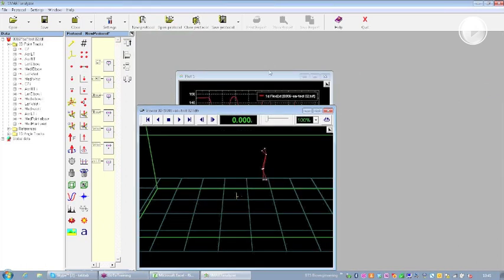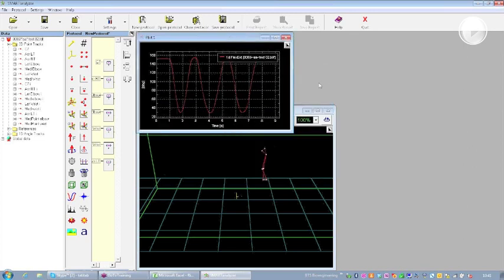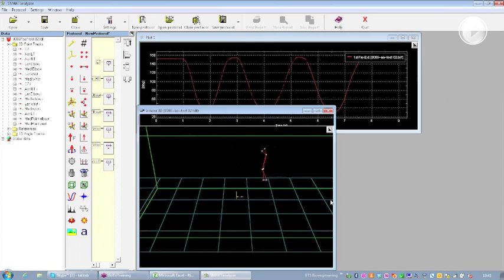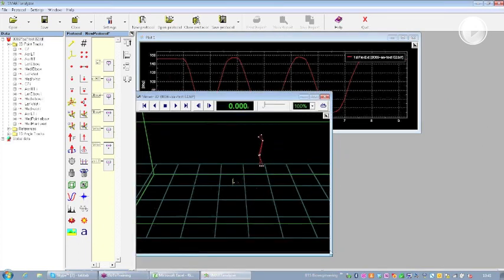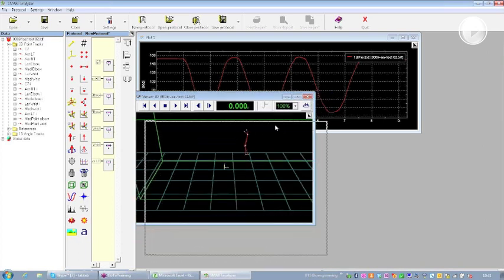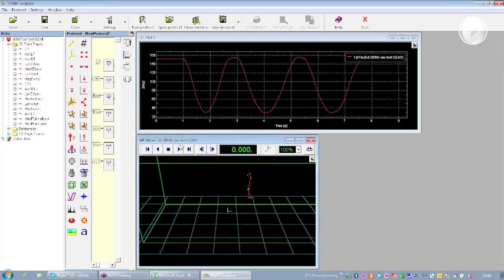We start the acquisition with the elbow completely extended, and we go through a condition of flexion. I just want to reduce it to show you together that if I click play over here, also my angle is going to move according to the reconstruction.